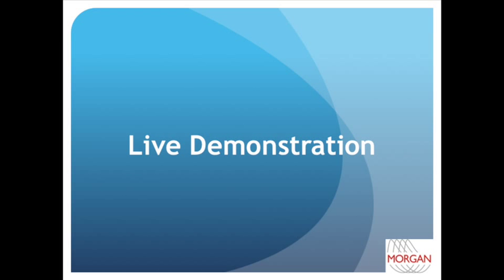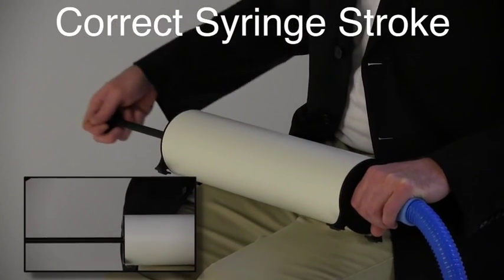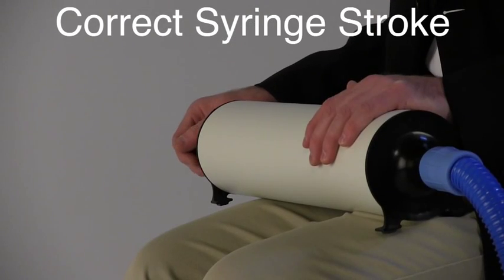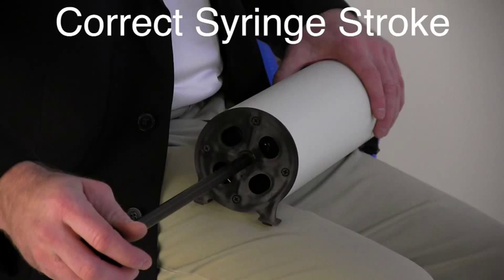Let's watch a live demonstration of some correct positioning for using a 3-liter syringe. The syringe should be positioned flat on the lap. One hand is used to stabilize the syringe while the other operates the piston. The piston is pumped completely in and out, gently bumping the end of the syringe. Each syringe stroke is smooth regardless of how fast the piston is being pumped.